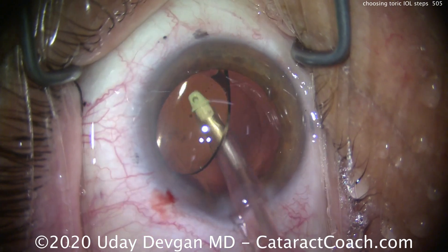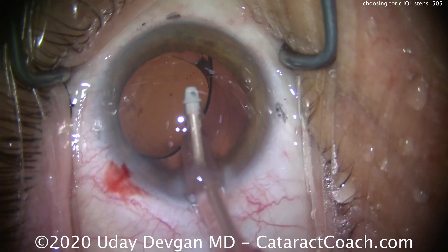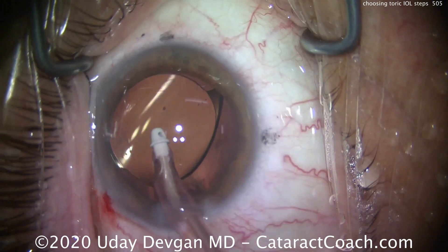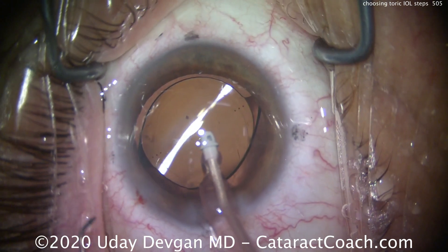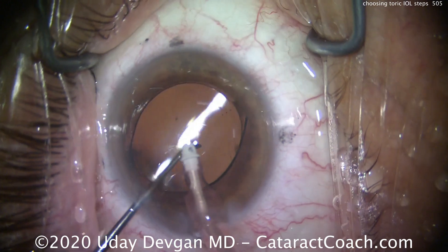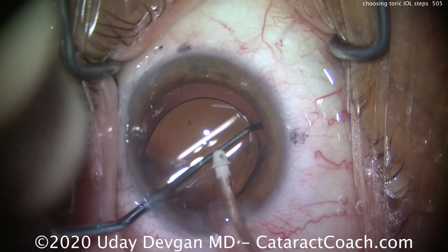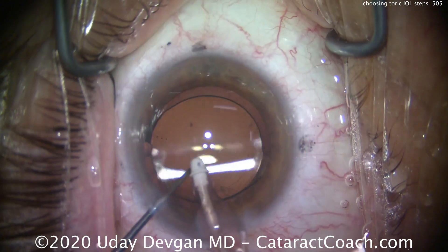You also have to take into account the phaco incision and where it lies. In this case, the astigmatism is with the rule but the incision is against the rule, so whatever effect that incision has must be accounted for. You also have to go behind the lens and remove all viscoelastic, because removing it helps the lens stick to the posterior capsule and avoid malrotation — if you leave viscoelastic, it acts as a lubricant and the lens can slip.